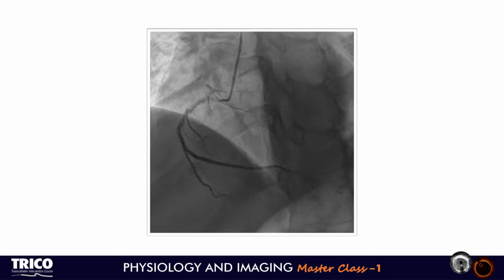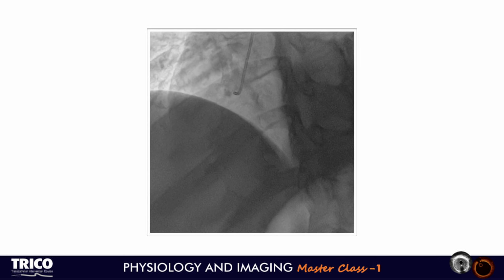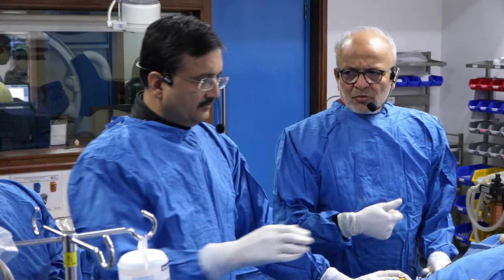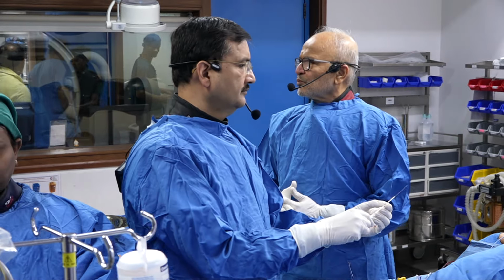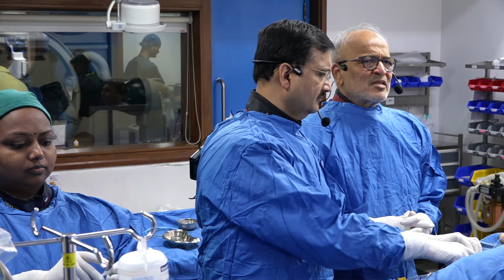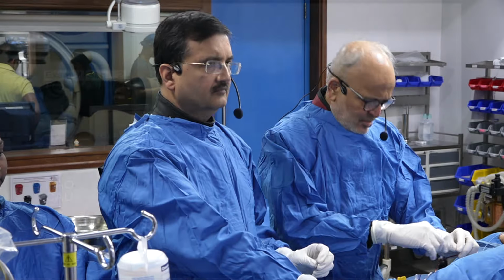Excellent. Now we see the angiograms very well here. Okay. So, run through. Sir, what do you expect from imaging as you are the experienced? This is a plaque rupture case. Okay, sir. And a big thrombus there.